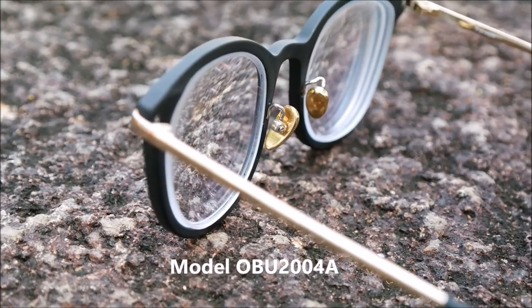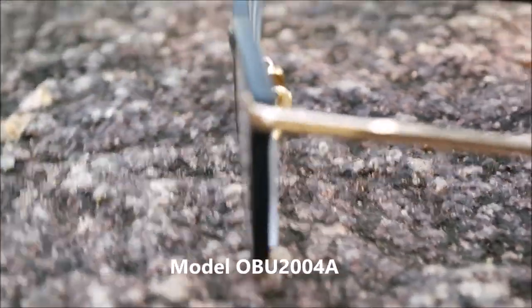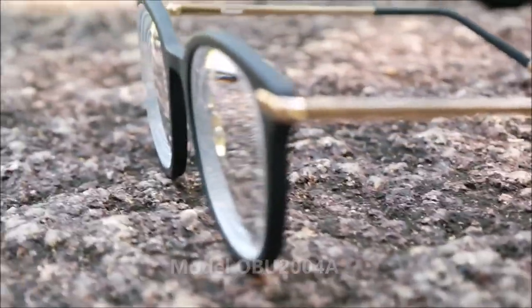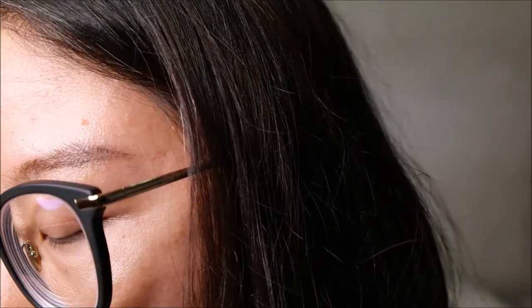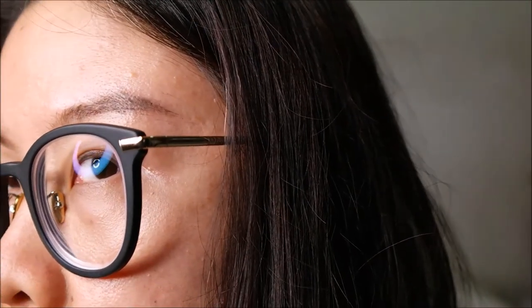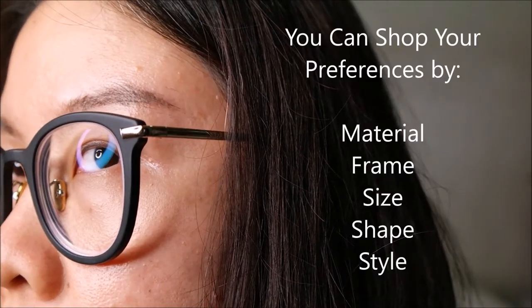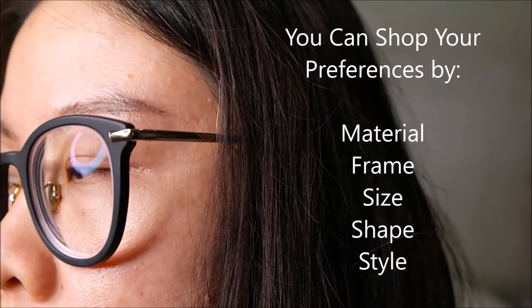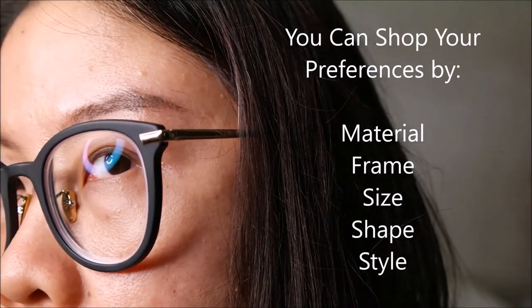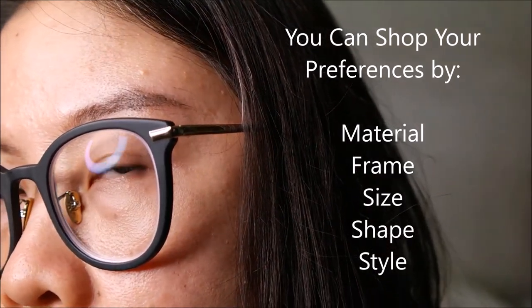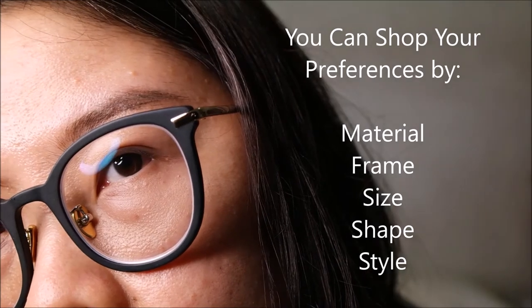The model of this pair of glasses that I'm wearing is OBU 2004A for those who want to know. The reason why I picked this design is because I want to go for an oversized frame this time around because my other glasses are of smaller rectangular frames so I thought I should try a different look this time.